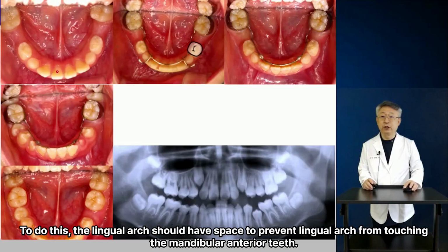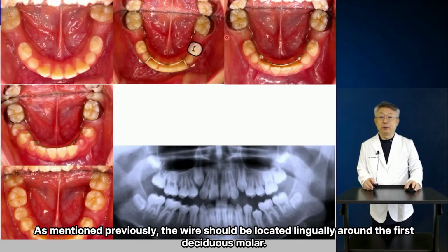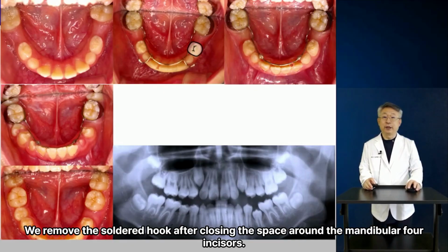To do this, the lingual arch should have space to prevent it from touching the mandibular anterior teeth. We can use 5/16, 6 oz light force elastics on the left and right soldered hooks. As mentioned previously, the wire should be located lingually around the first deciduous molar. We remove the soldered hook after closing the space around the mandibular 4 incisors.